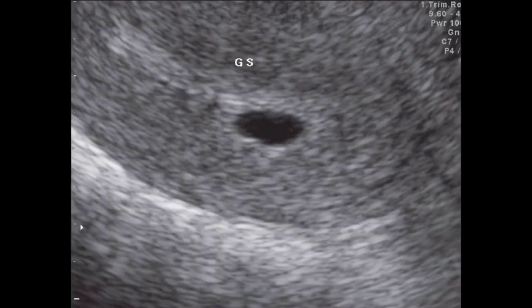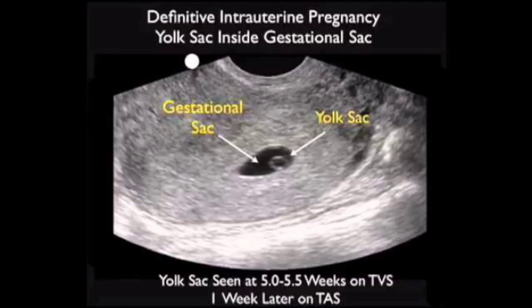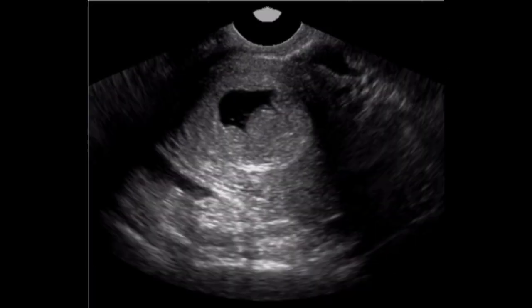An abnormally shaped gestational sac or yolk sac should raise concern for a failing pregnancy. The gestational sac should normally be round or oval. An irregular gestational sac with angulations or teardrop shape is associated with a poor prognosis.